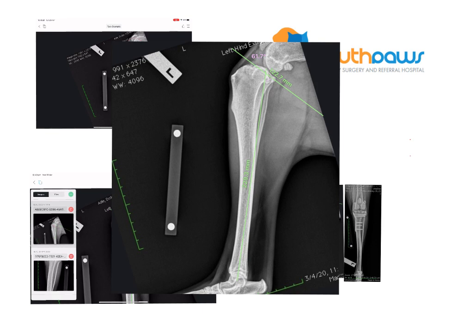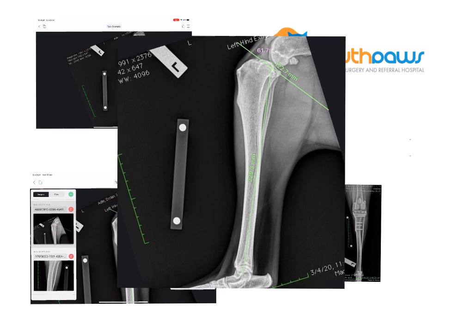When we do this TPLO plan we are going to be working off a lateral stifle radiograph. On this stifle radiograph the first thing we're going to look at is what the tibial plateau angle is. The tibial plateau is represented by this line just here, and we want to look at the angle that that makes with the long axis of the tibia, which is this line right here.